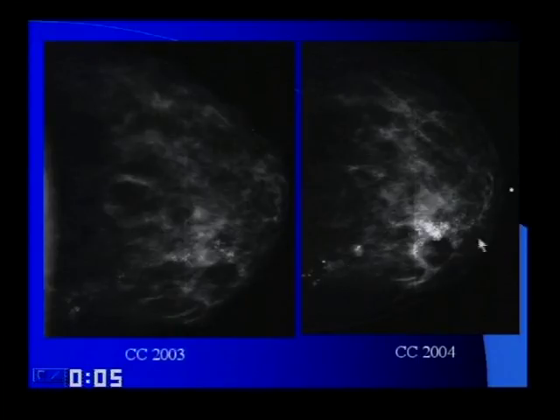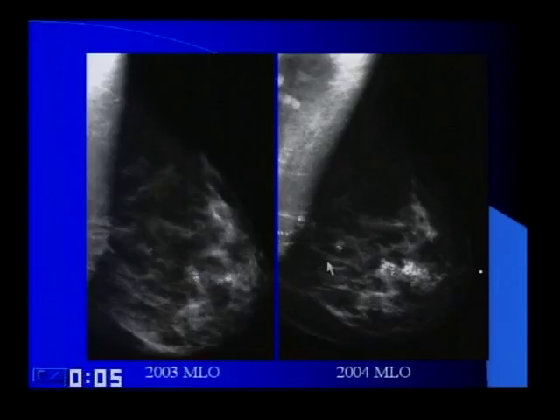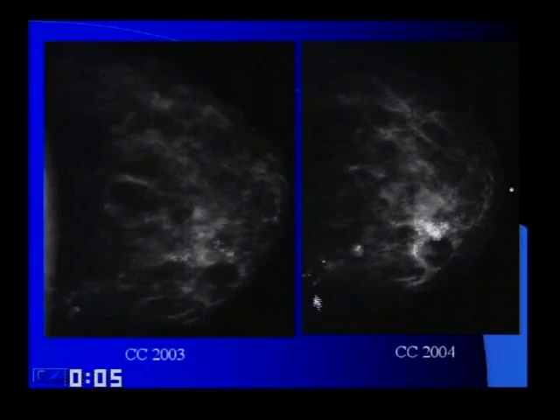And what's changed, Chris? Number of calcifications has increased. Especially anteriorly here, this whole area has increased. And better seen here on the MLO, what's happened right here? Well, I mean, there's suggestion of invasive ductal cancer. Invasive ductal. So this is what the comedotype, our high-grade DCIS does. It's very aggressive, and if you don't treat it immediately, it becomes invasive.